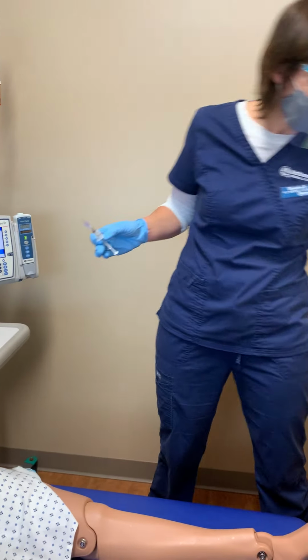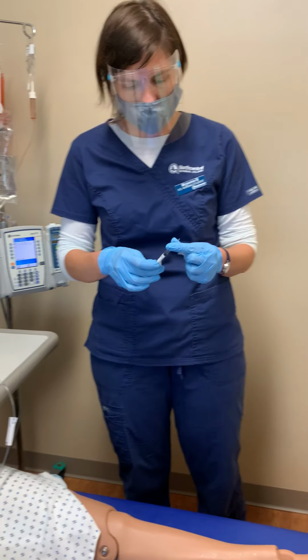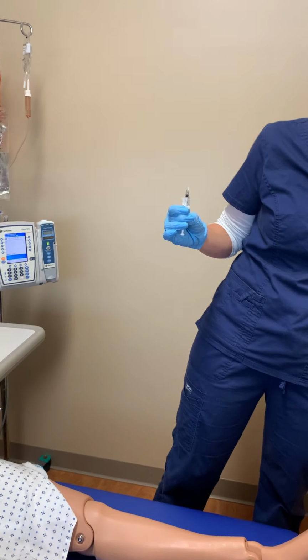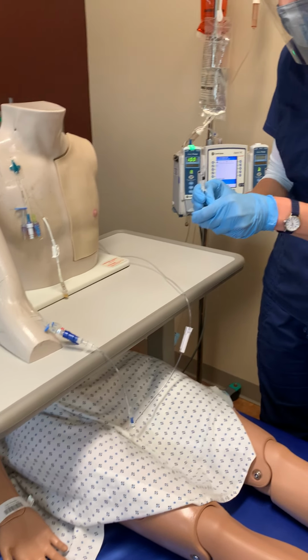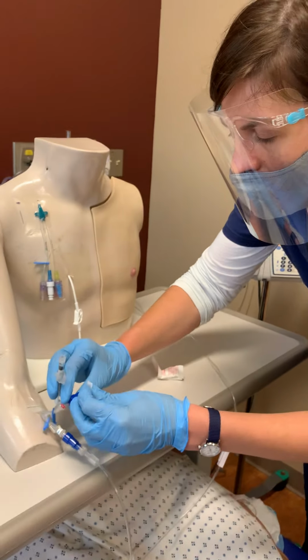I'm going to come over with another alcohol swab, and I can remove my VAD. And we're going to use this other lumen.